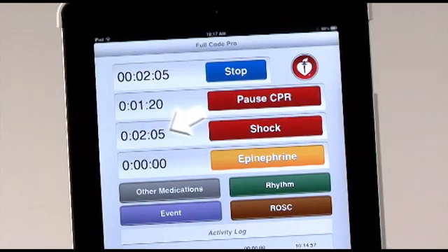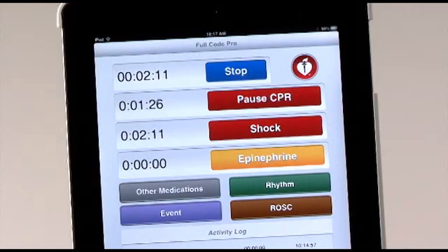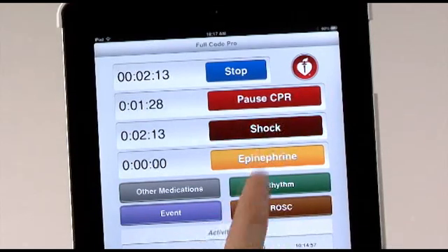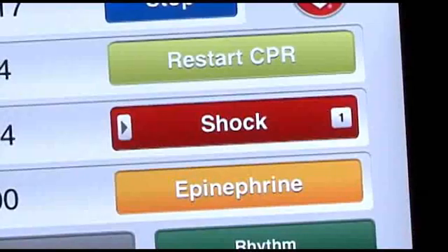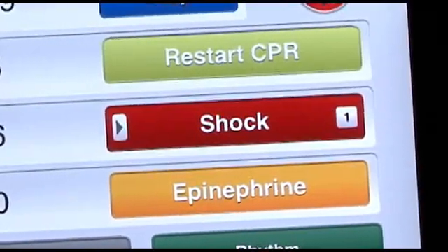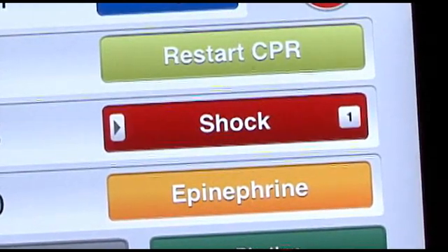The shock timer will start when the code begins and displays the elapsed time before or between defibrillation attempts. Selecting the red Shock button resets the shock timer. The number of shocks administered is displayed on the far right of the shock button.